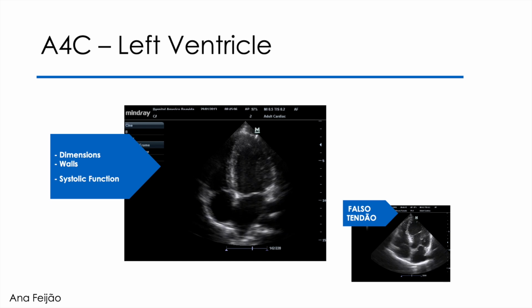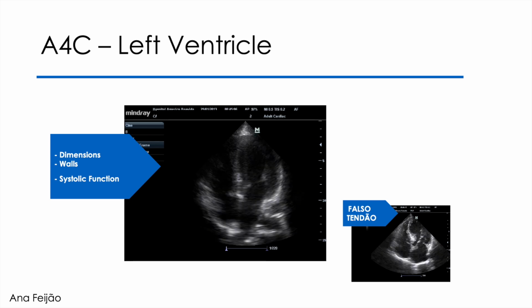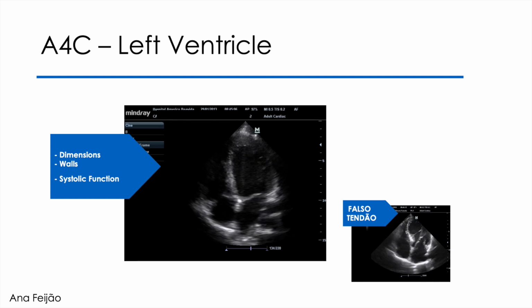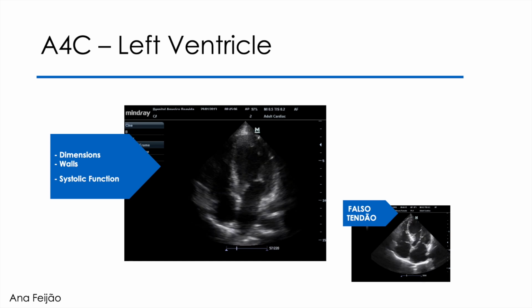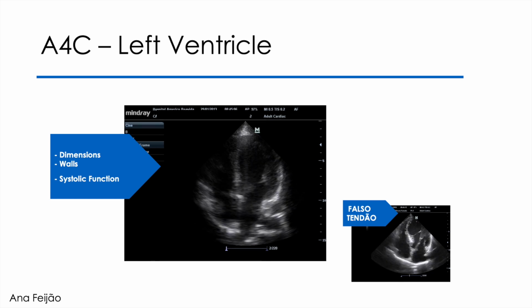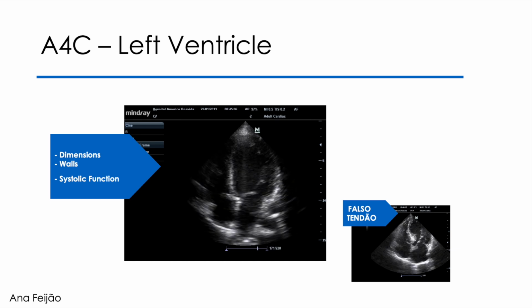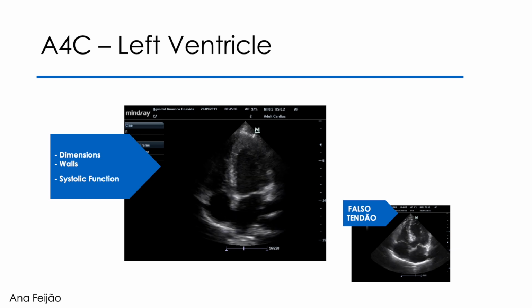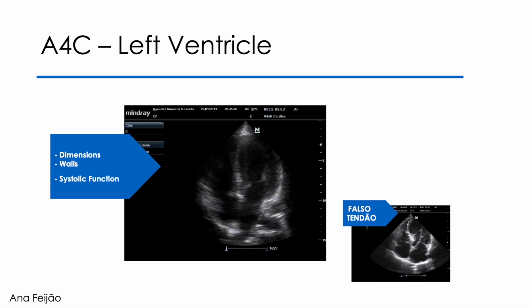Regarding trabeculae, they are invaginations of the myocardium into the cavity. It is normal for them to exist in the right ventricle, but not in the left ventricle, as there is an embryogenic process that compacts these myocardial fingers and gives a smooth appearance to the left ventricular endocardium. But what is certain is that it is common to find trabeculations in the left ventricle, and it is necessary to mention them in a report. And, of course, diagnose whether there are criteria for non-compaction of the left ventricle or not.